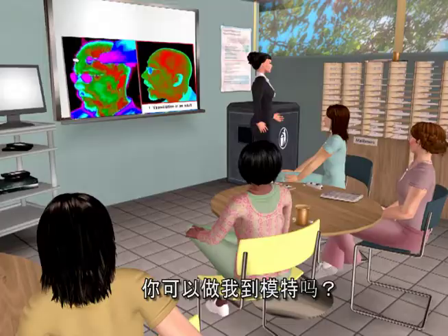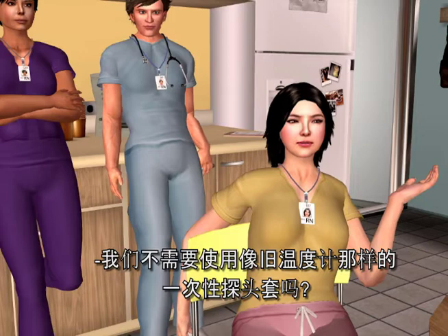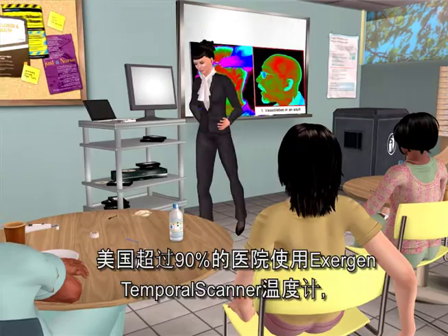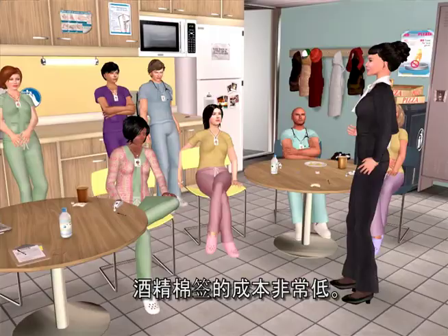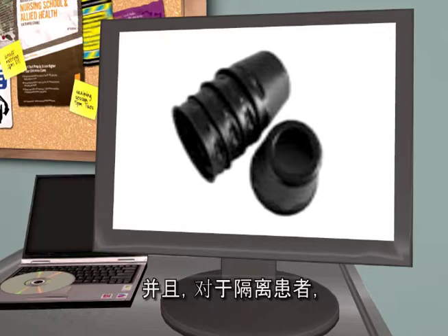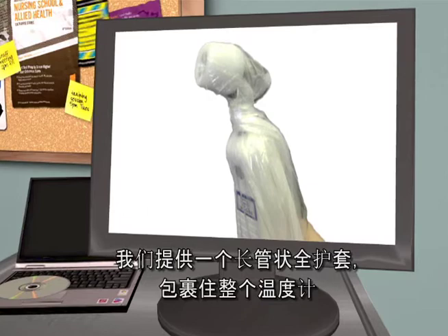Depending on the patient, you would first wipe the probe head with an alcohol prep pad, as you would with your stethoscope. With the temporal scanner, you're not contacting any mucous membranes, so in most cases covers are not required. More than 90% of hospitals using Exogen temporal scanner thermometers have approved wiping with an alcohol prep pad. Should the hospital prefer additional protection for certain patient populations, we offer disposable caps which can be reused on the same patient, and for isolation patients, we offer a long tubular sheath that encloses the entire thermometer for optimum protection.